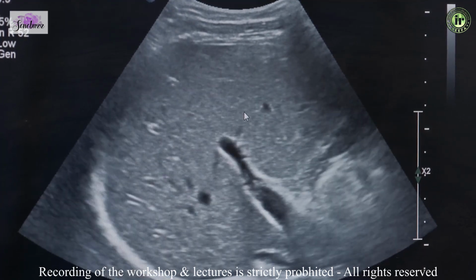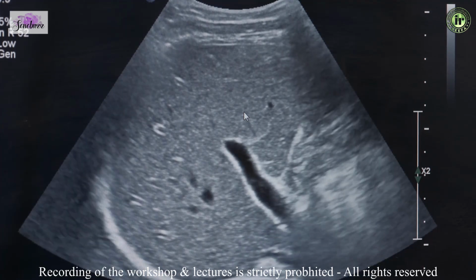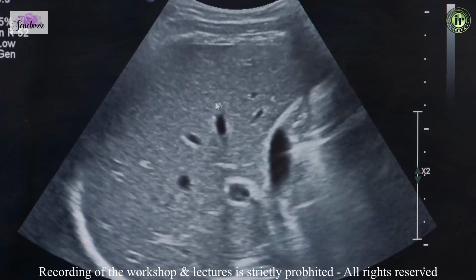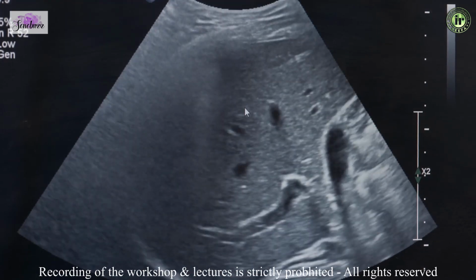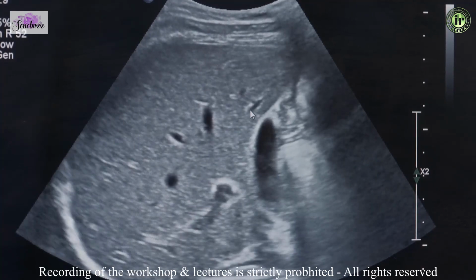As long as we don't go in the left lobe of the liver, because what happens over there is we are getting pulsations from the heart, and that is going to hamper our values. Also, you don't want to go very close to the diaphragm, because again you're going to get reverberation artifacts over here. So anywhere on segment 5, 7 and 8 is absolutely fine.